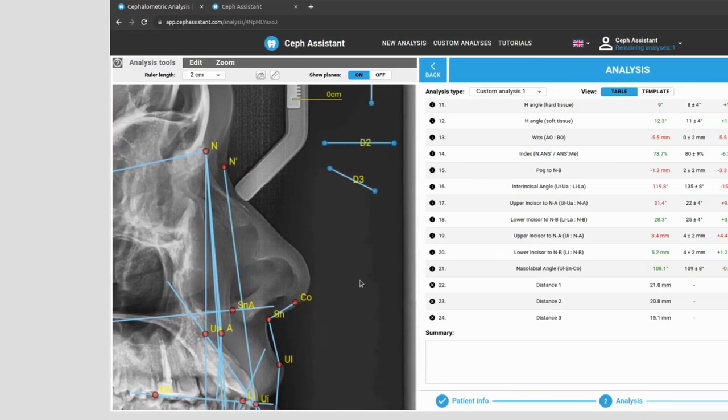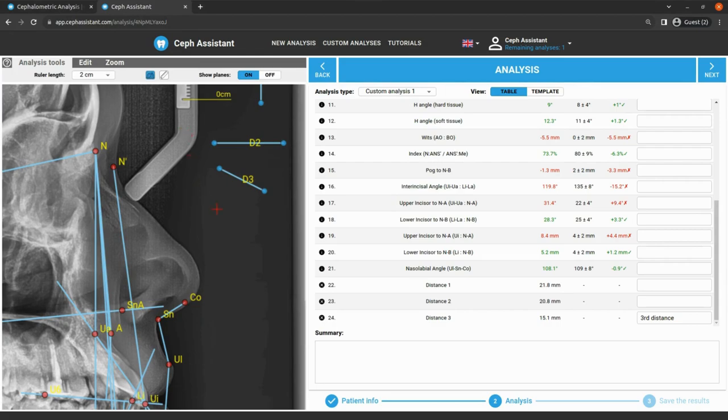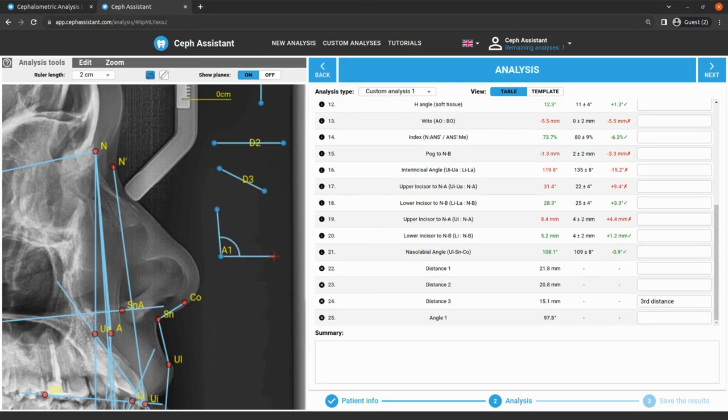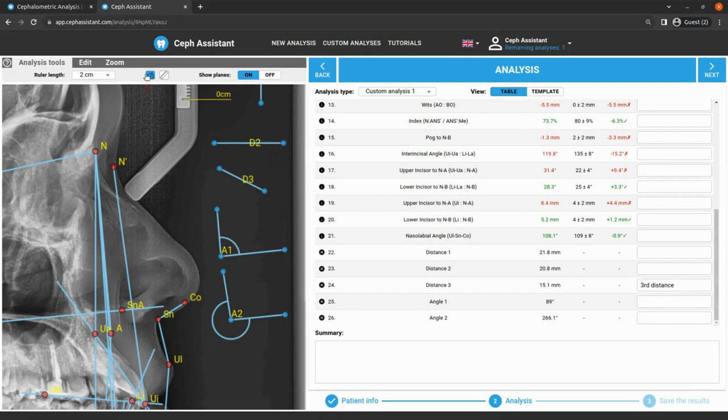To measure an angle, you should execute almost the same process. Select the tool, then place the three reference points. To get the opposite side of the angle, start the placement in the reverse order. Once you've finished, click on the tool again. You can adjust your placement and the results will be updated immediately.